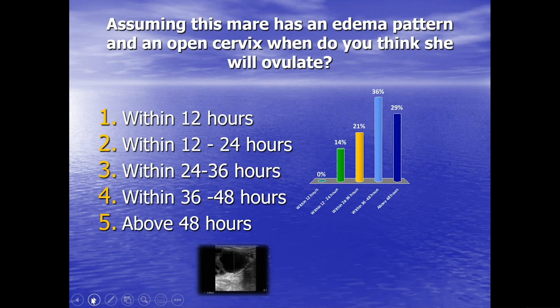Now, if we look at what people asked when I last polled the question, the majority figured within 36 to 48 hours. A significant percentage said above 48 hours, and a good percentage within 24 to 36 hours, and some even within 12 to 24 hours.